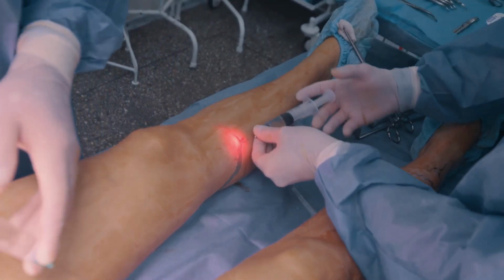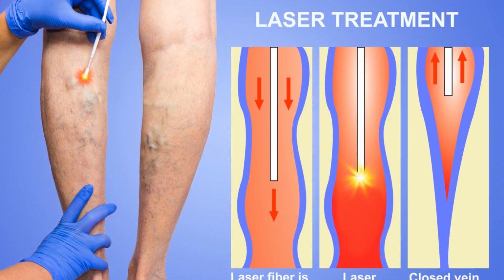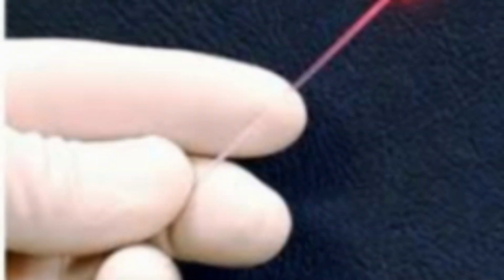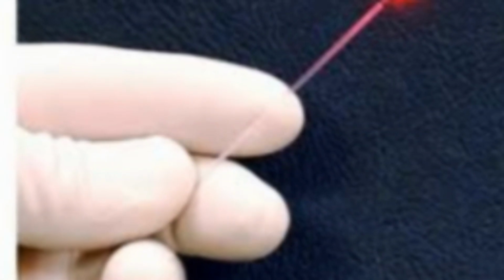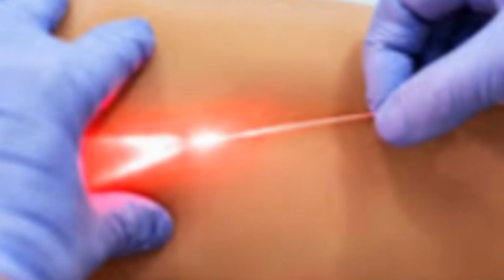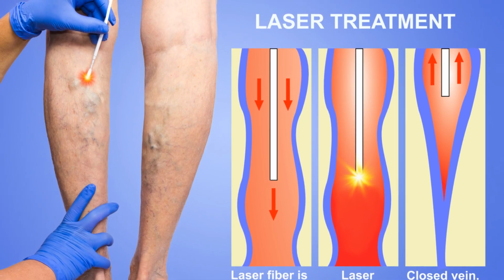First, recent research and mathematical models show that the initial heating of blood and the vein wall is actually independent of the laser's wavelength. That's right, whether the laser is tuned for hemoglobin or water, the temperature response is the same. Now, you might assume that the inner wall of the vein absorbs most of the laser's energy, but in reality, direct absorption by the vein wall is pretty limited, and almost no photons from a 1470 nanometers laser even reach the inner wall. In fact, even in a totally collapsed vein, direct photothermal effects account for only about 20% of the energy increase at the wall.